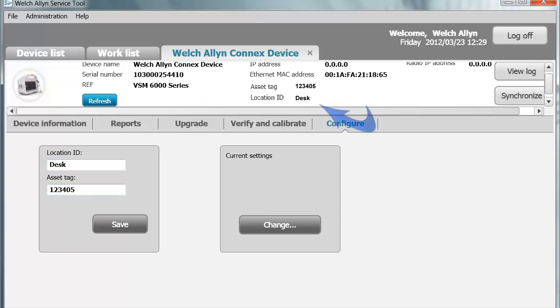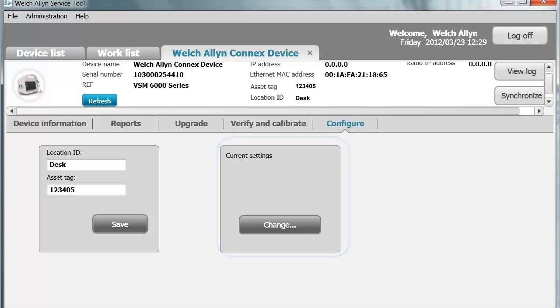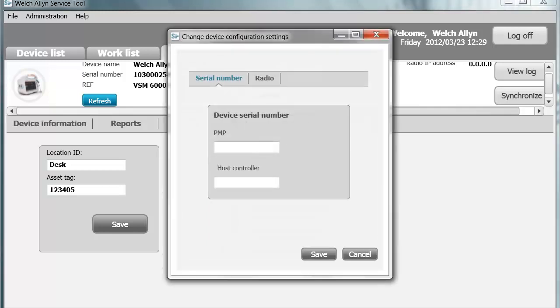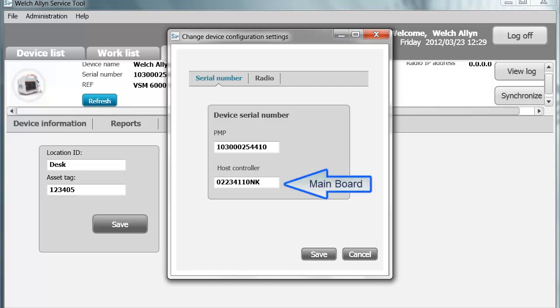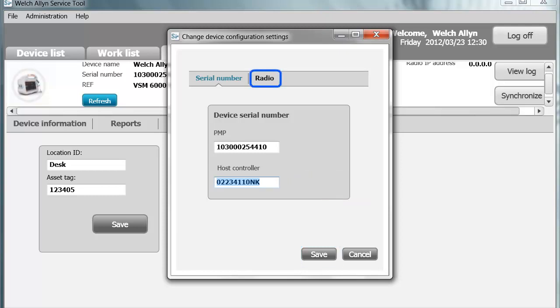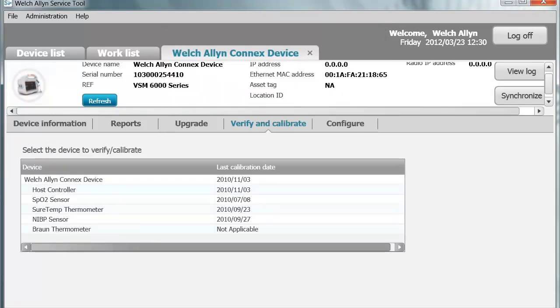After saving, it will write that information to the device and show it on the Device Information tab. Under Current Settings, if you repair your device and need to replace the main board or host controller board, you will need to click Change on the Current Settings tab and type in the serial number from your device and the host controller serial number — there is a sticker on the main board. On the Radio tab, if you have a radio on your device, you can configure your radio. You must configure the radio on the CVSM and CIWS to have an IP address before using this function.